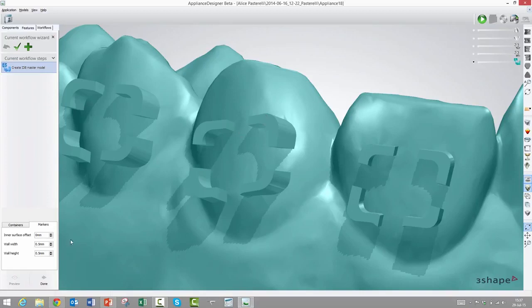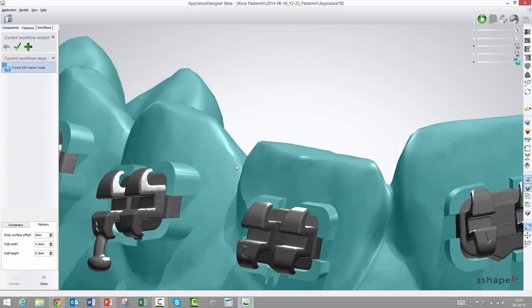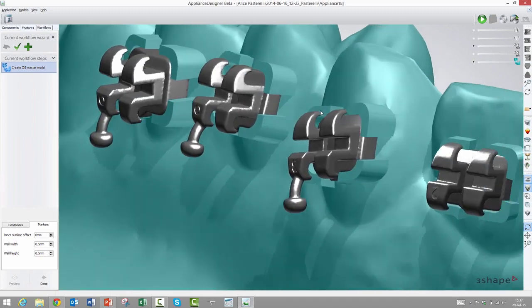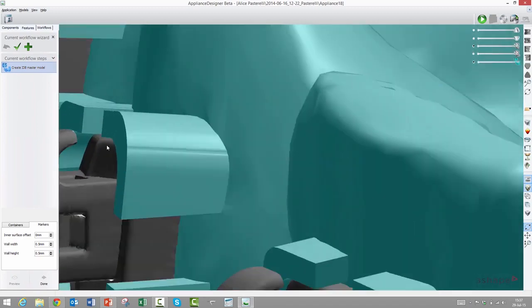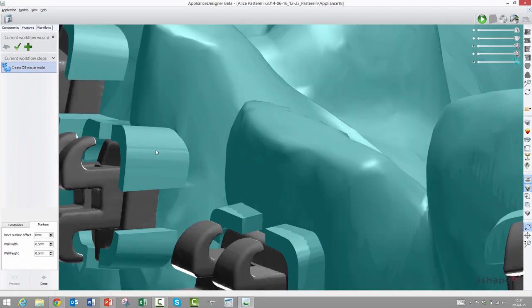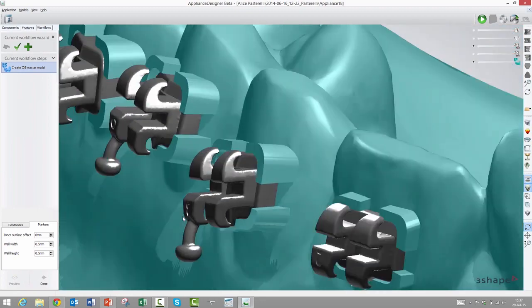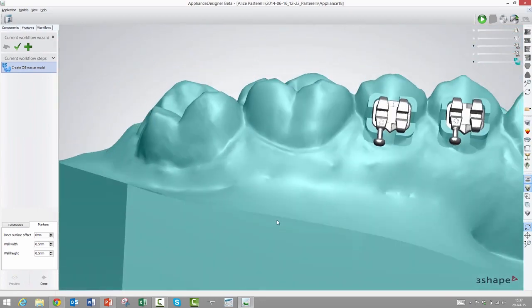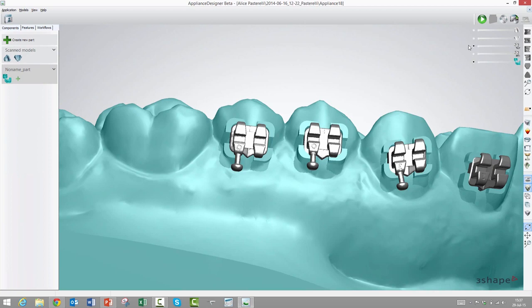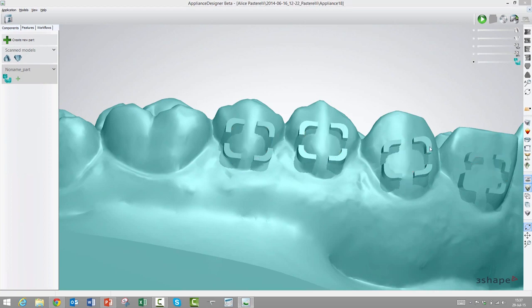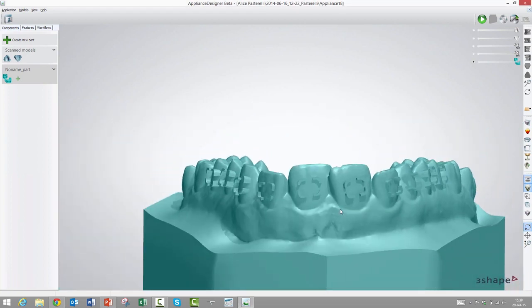In fact, it's done already computing this, and this is fully automatic depending on what bracket library you have chosen. The next one, the wall width and height, we can almost guess what that does. A quick word on what they are useful for: the height could be useful because if we have a bracket with a very low profile where maybe the wings are very close to the tooth surface, then maybe we will need to reduce the height of the walls here to make sure that they don't collide.